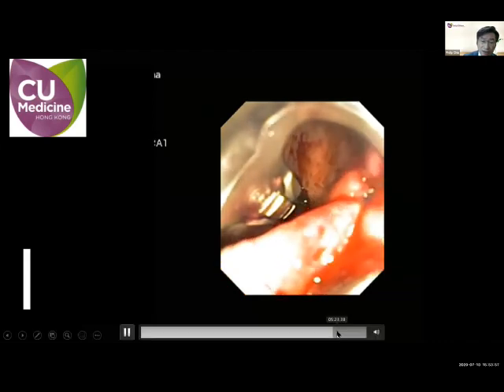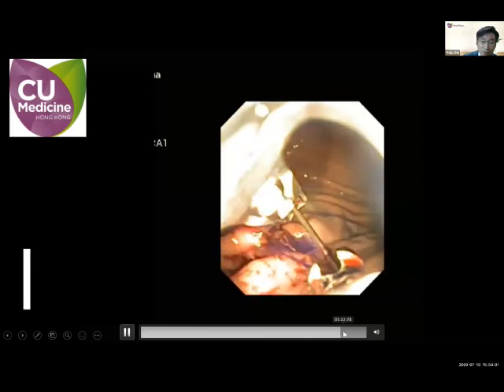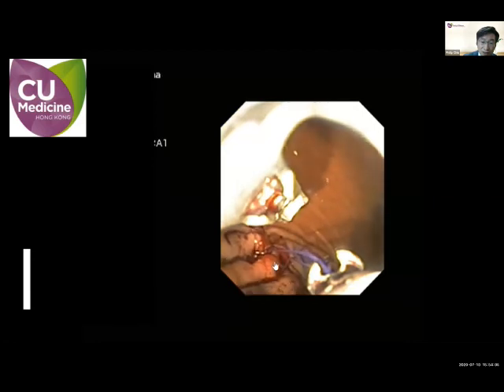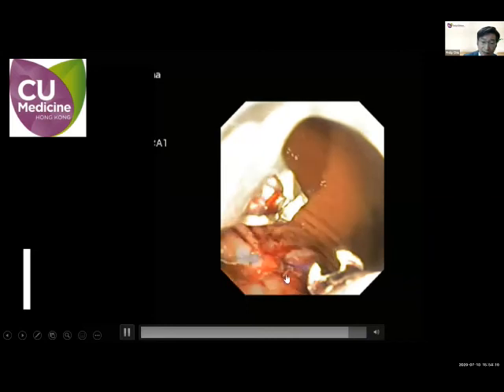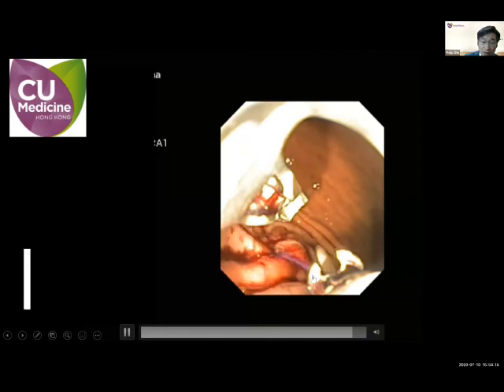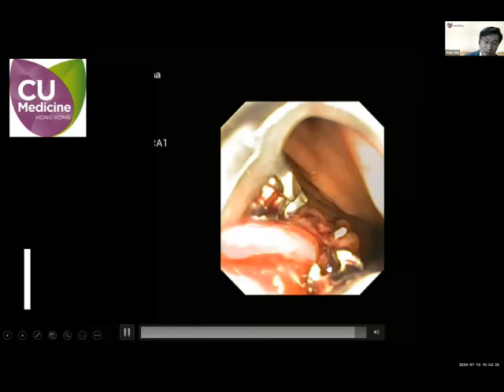After the completion of the suture, we tighten up the suture by using a cinching device. Now I just drop the needle, which acts as one of the ends, and afterwards I will use the cinch and tighten the suture.